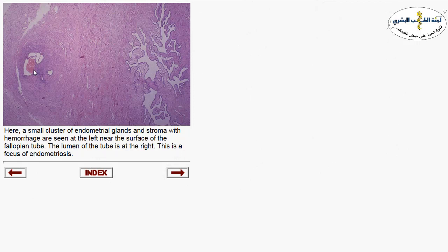Here you see the fimbriated lining of the fallopian tube. Within the wall of the fallopian tube there is a focus of endometrial glands and stroma — this is called endometriosis, meaning endometrial glands and stroma outside the endometrial cavity. The endometriotic glands respond to hormones during the menstrual cycle, causing hemorrhage, secretory changes, shedding, and proliferation.